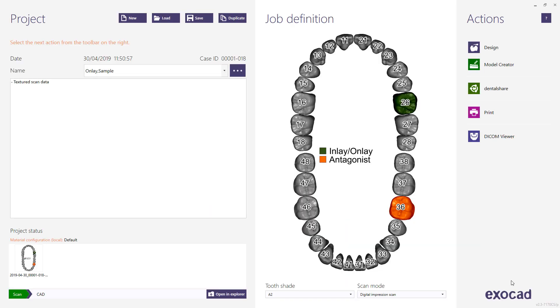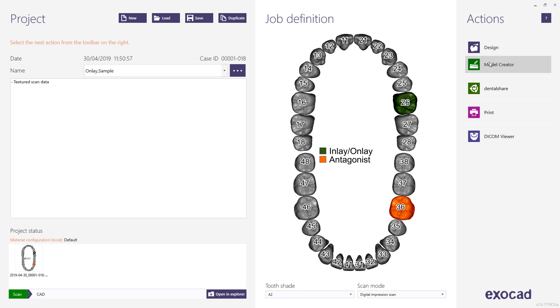The job definition includes an antagonist. Next, choose Design from the action menu to start the CAD application.